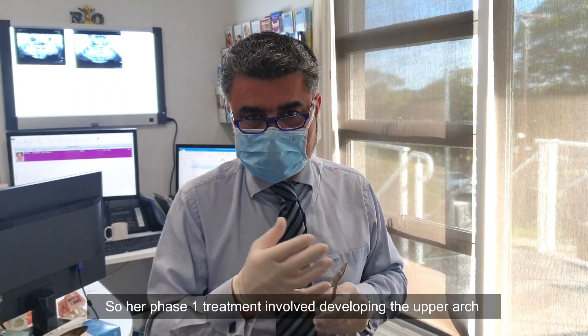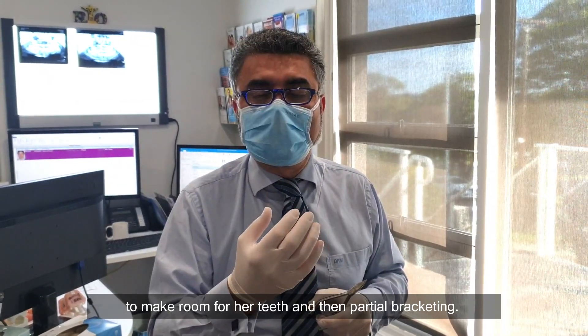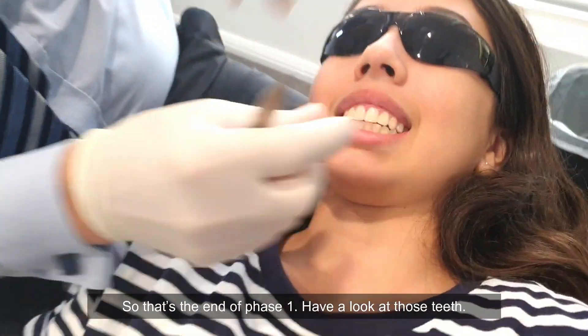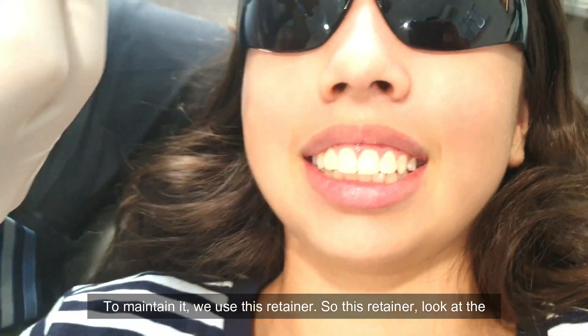Her phase one treatment involved developing the upper arch to make room for her teeth and then partial bracketing. So that's the end of phase one. To maintain it, we use this retainer.